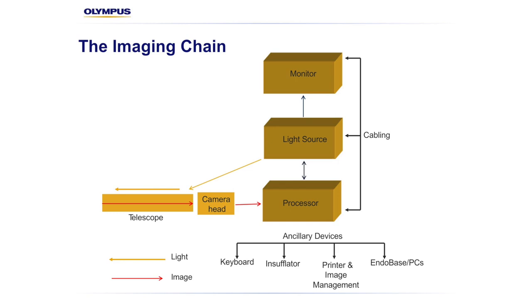A solid understanding of the imaging chain components is crucial to help you deliver an image that's of the best possible quality for your customers and patients. Advancing your understanding of the imaging chain can help you to work closely and consultatively with your customers, not only to troubleshoot when something goes wrong, but also to help optimize their experience in the OR.